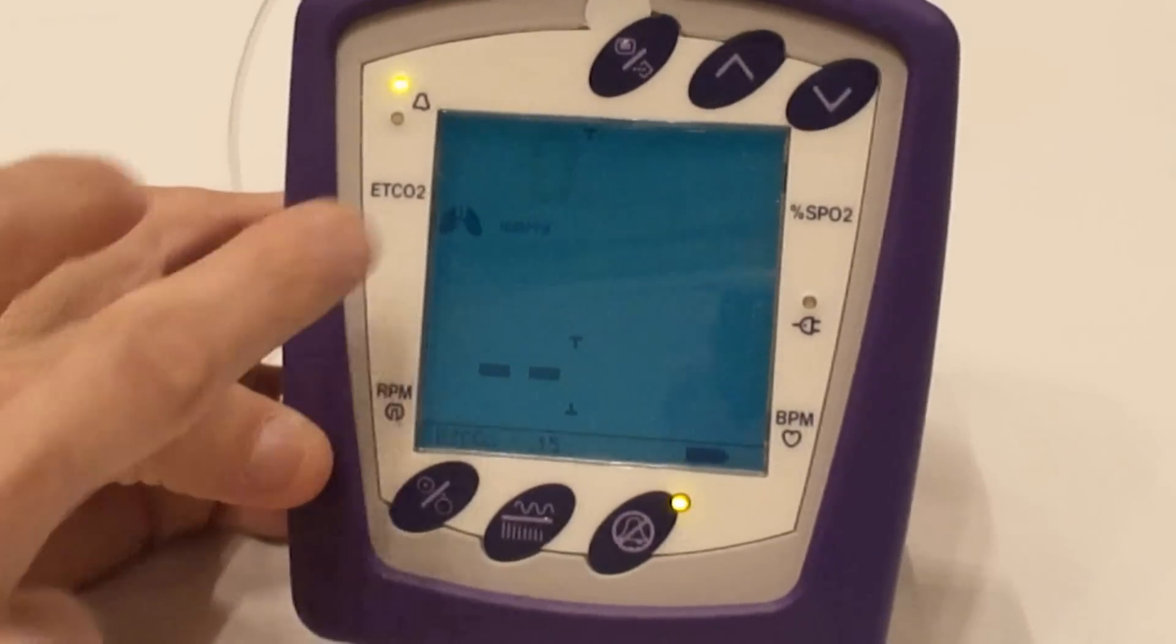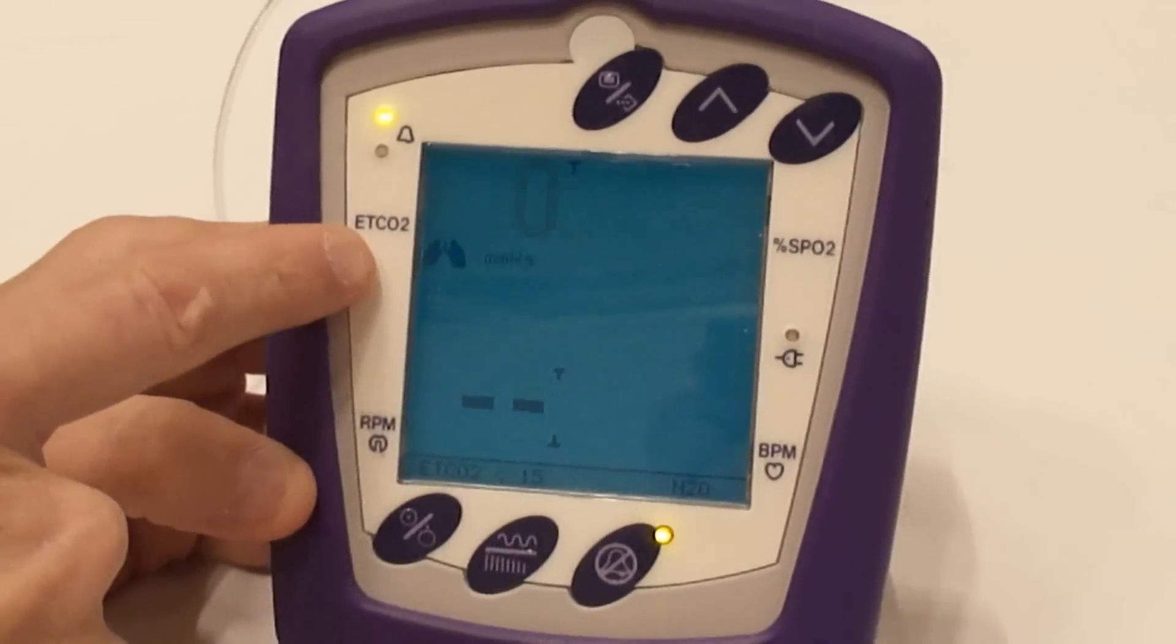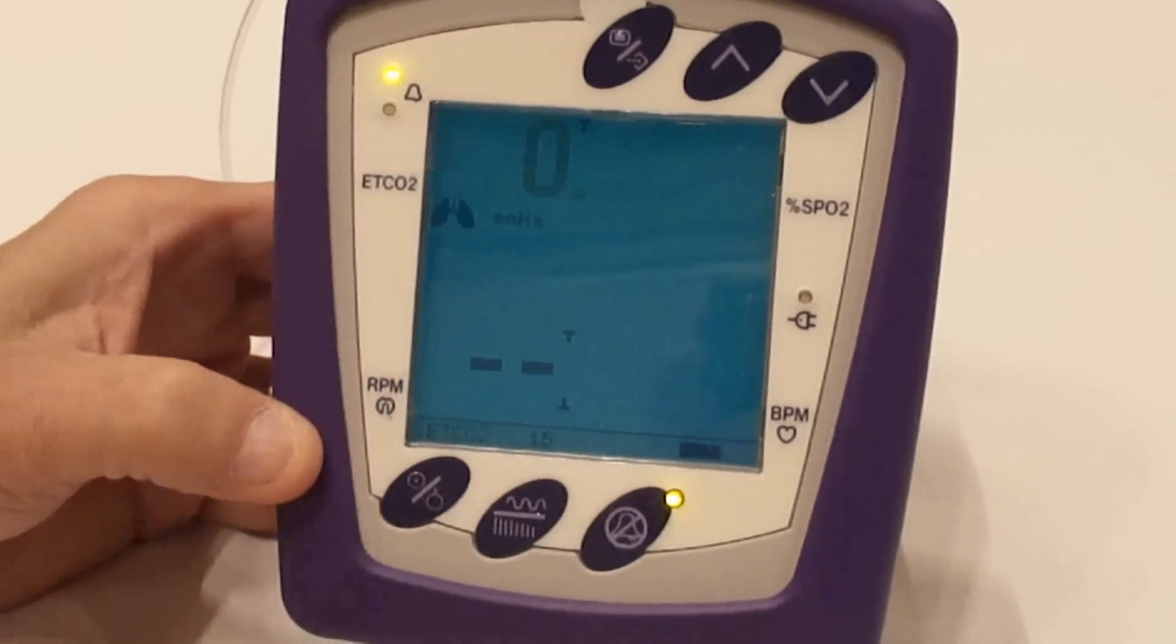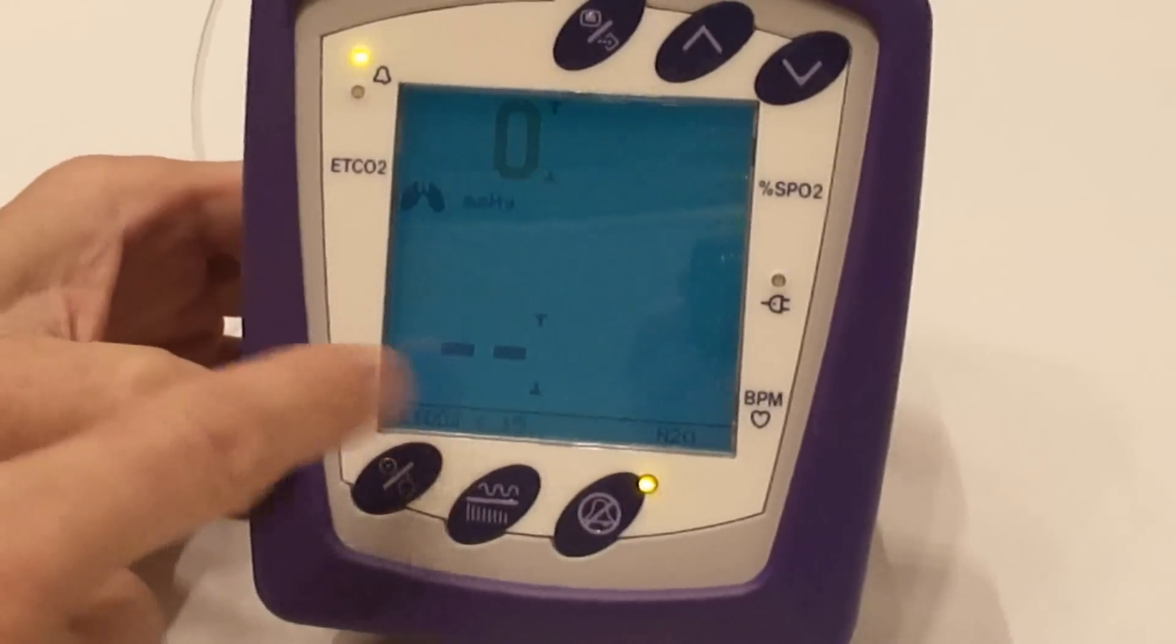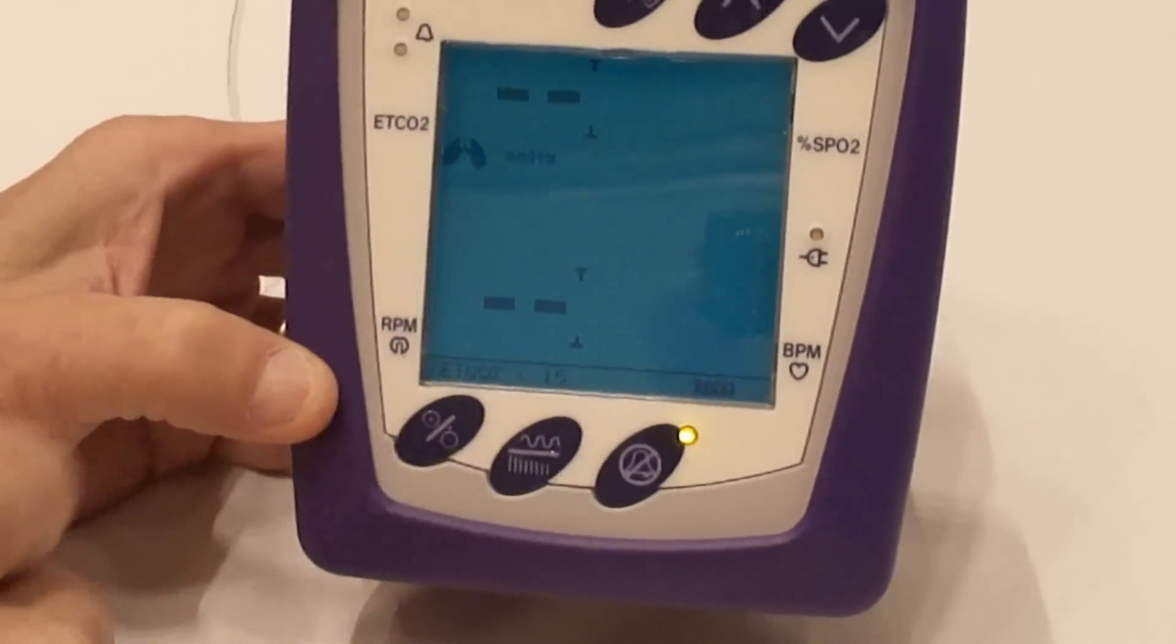As you can see there, up top here, you have where you're going to be monitoring your end-tidal CO2 through the nasal cannula. And then down here will be your respirations per minute.